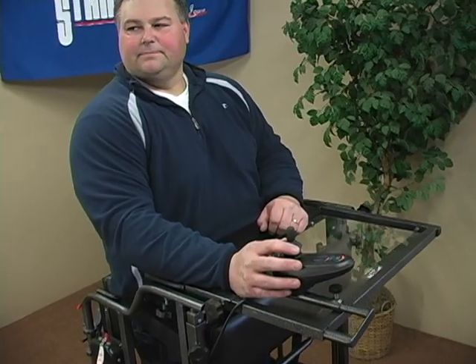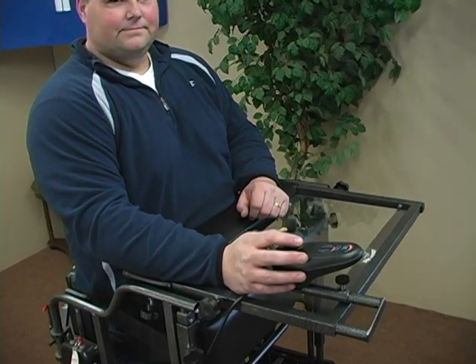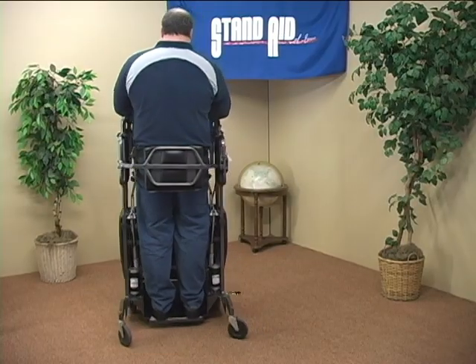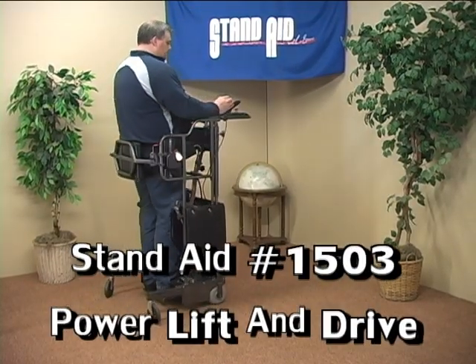Let Stand-Aid of Iowa help you discover the many benefits of passive standing with the Stand-Aid Model 1503 Power Lift and Drive.